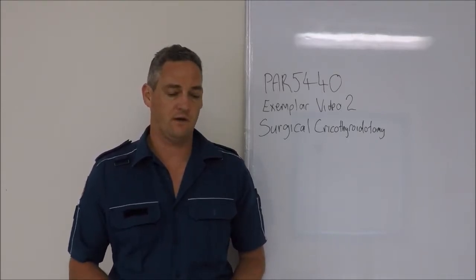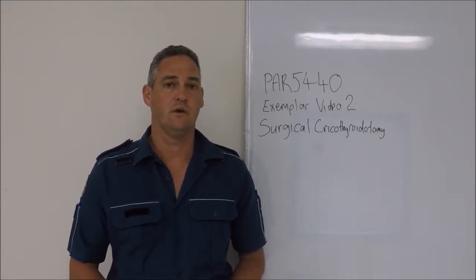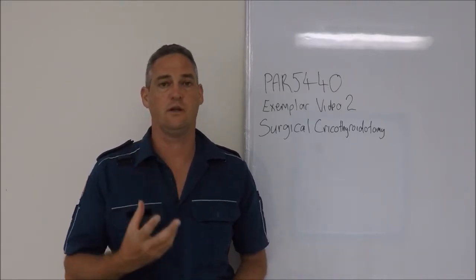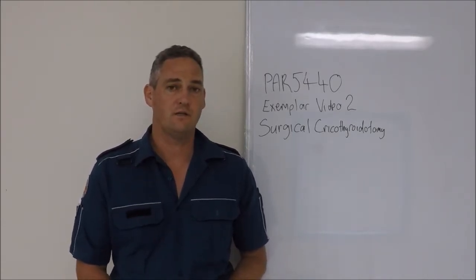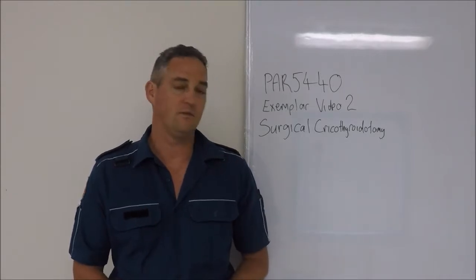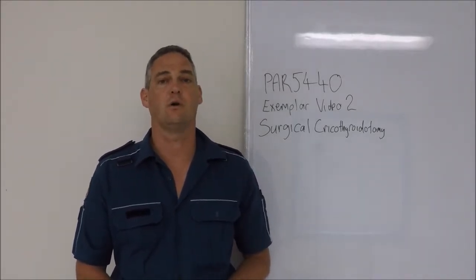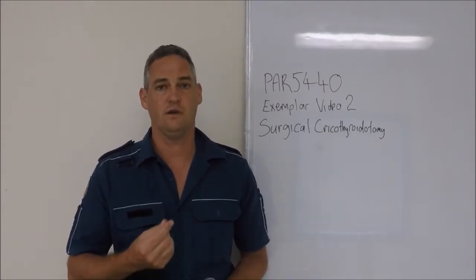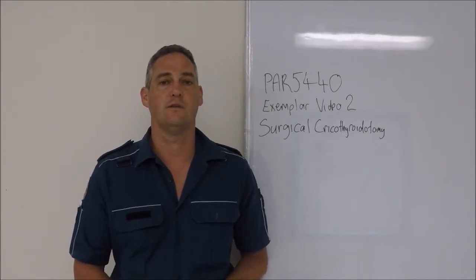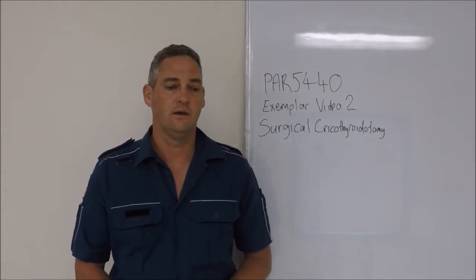The QAS has an indication for can't intubate, can't ventilate situations or severe facial trauma that contraindicate an initial laryngoscopy. It is contraindicated for under the age of 12, and due to the requirements for this presentation to talk about different age groups, I'll also briefly talk about a needle cricothyroidotomy that will allow some emergency transtracheal ventilation to enable oxygenation until that patient can get to someone that can do a definitive surgical airway.